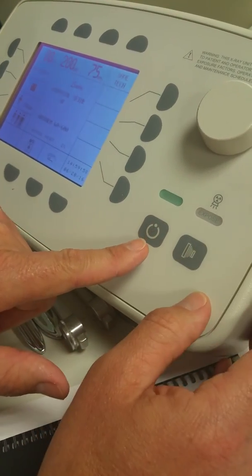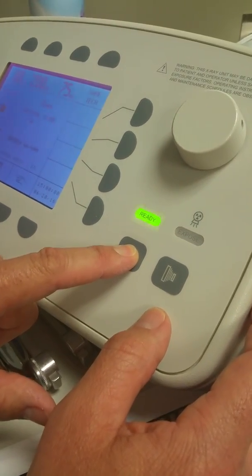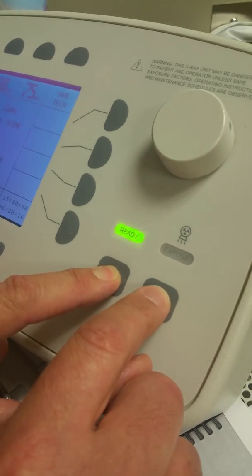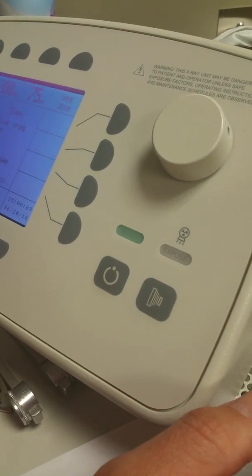So I'm going to show you right now. So we're going to go push in. I usually tell the patient breathing instructions. Once it's ready, then we push the second button, and that's it. Once you hear the beep, you know it's taking the picture.